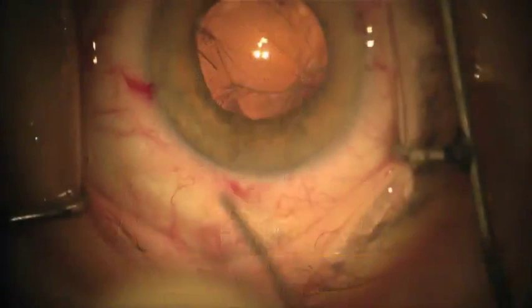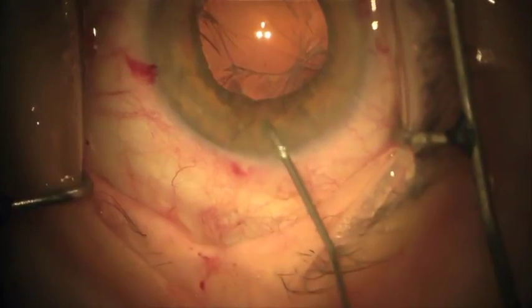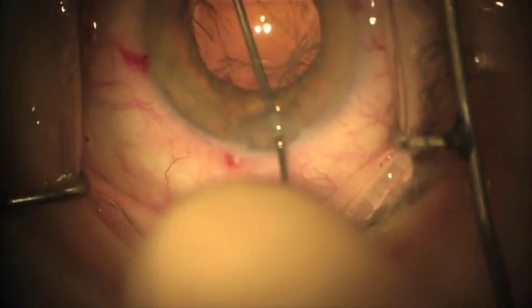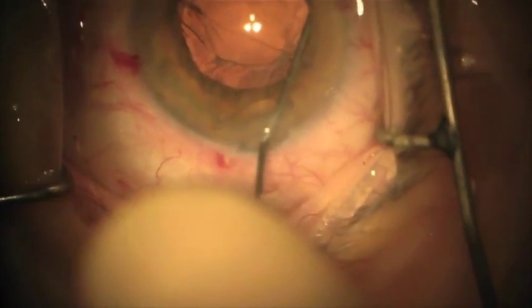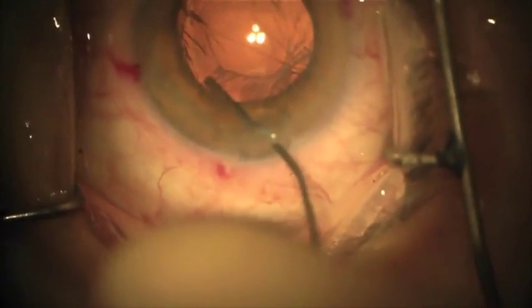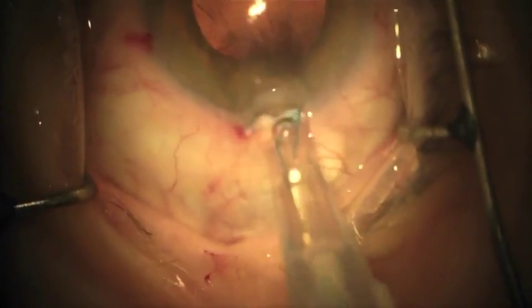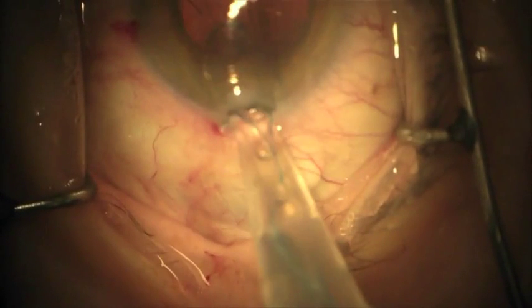Now we will discuss the proper insertion of a three-piece lens in the sulcus. First, we fill the sulcus with a cohesive viscoelastic. This allows proper positioning of the lens. You may need to enlarge your wound to fit the B cartridge. Place the tip of the cartridge bevel side down into the wound. You will need to insert the whole cartridge tip into the chamber.